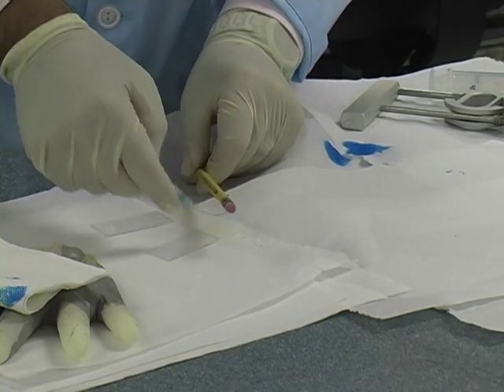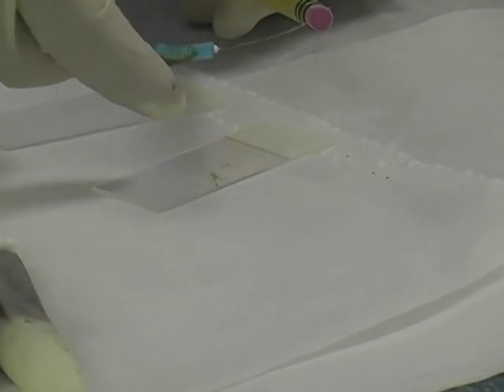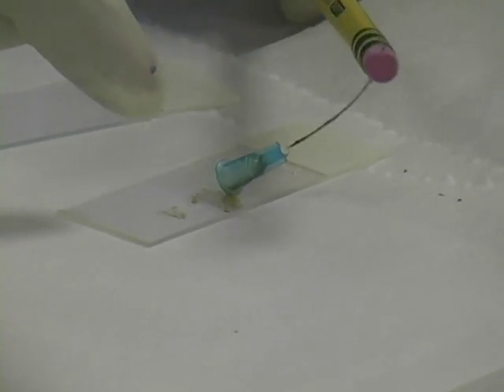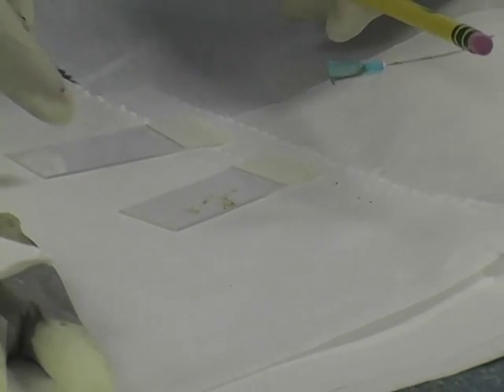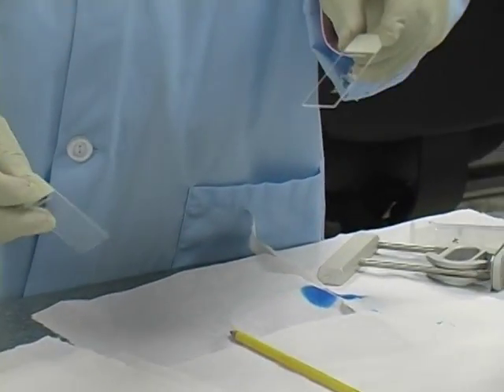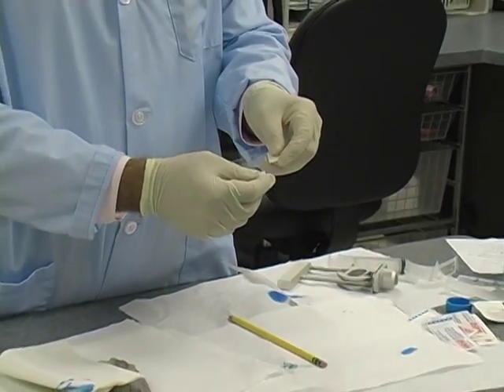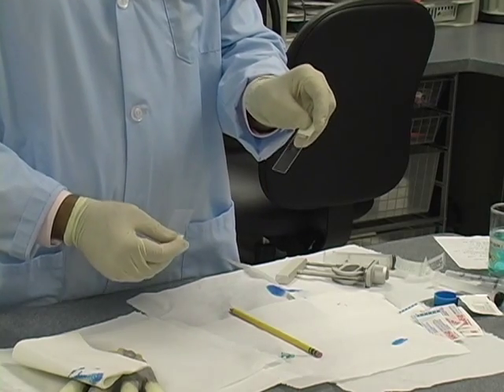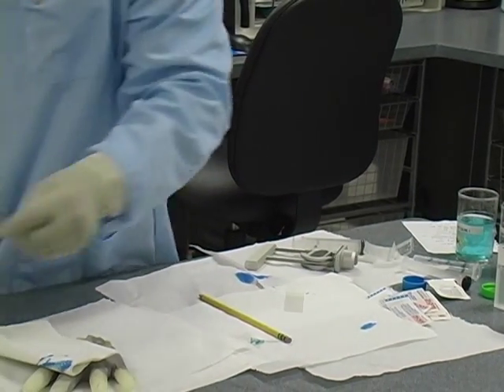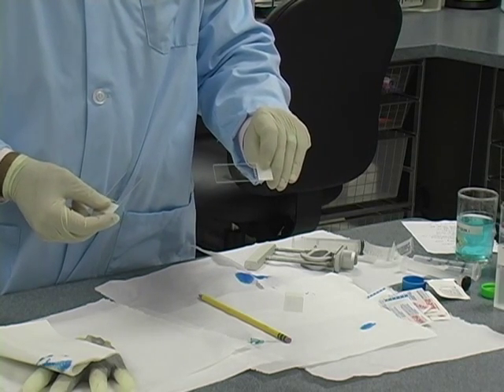You can see I'm flicking material from the hub that got stuck onto the slide — just this flicking motion. All that material that was stuck up in the hub is now being flicked onto the slide. There's a fair amount that I got out just by doing that flicking. Then it's the same process — take your slide, make a smear which you can stain with Diff-Quik or immerse in alcohol. Material that would have been lost stuck in the hub is now available to make smears with.